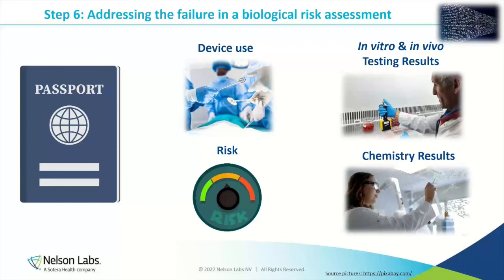So this is where we want to be really thoughtful about the use of the device and what these results mean to a patient exposure. So it's important that we give cytotoxicity testing the weight of evidence that it deserves and can provide, but it's, again, not the end-all be-all. It's just the beginning point and tends to be the hardest gate to get through, to get through biocompatibility. So I want to give an example.